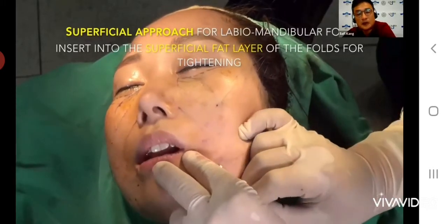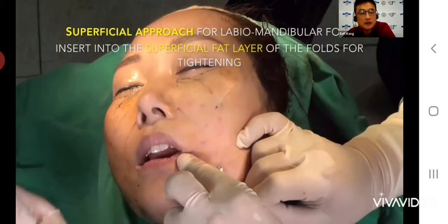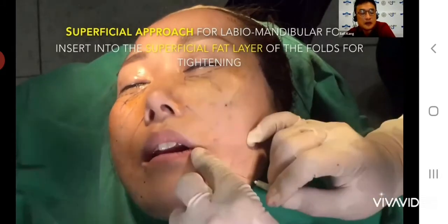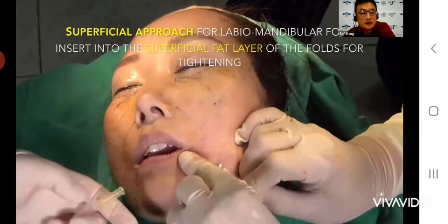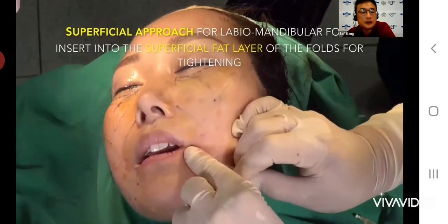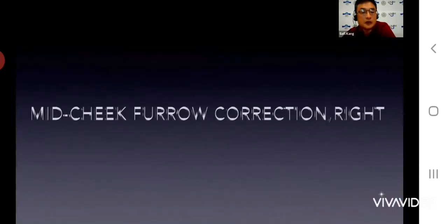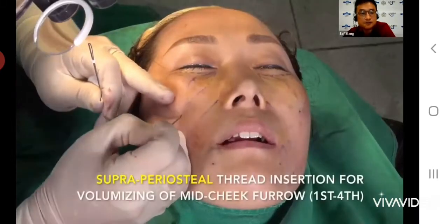There are many kinds of thread. The threads are manufactured for different purposes, so we can use them all to improve aging or to improve the development status of the face.